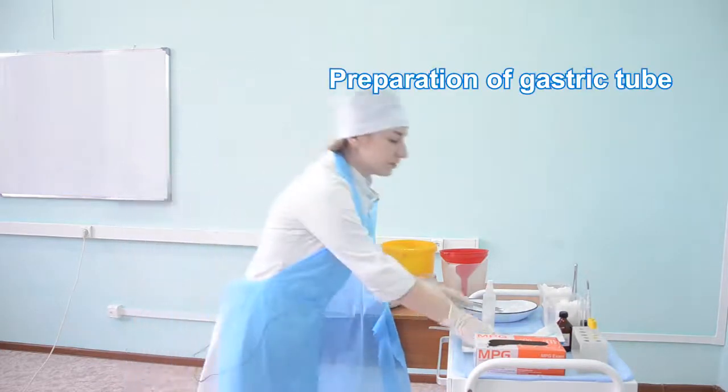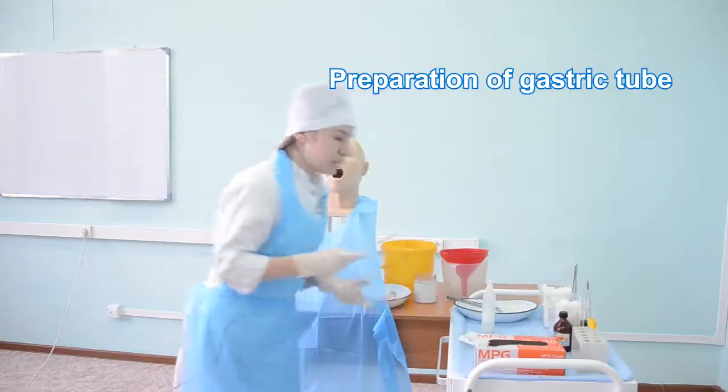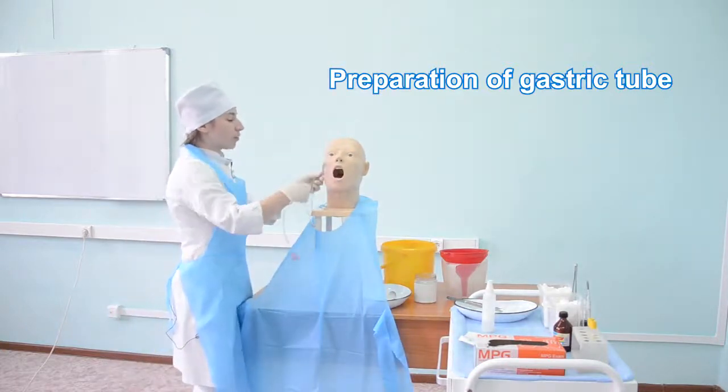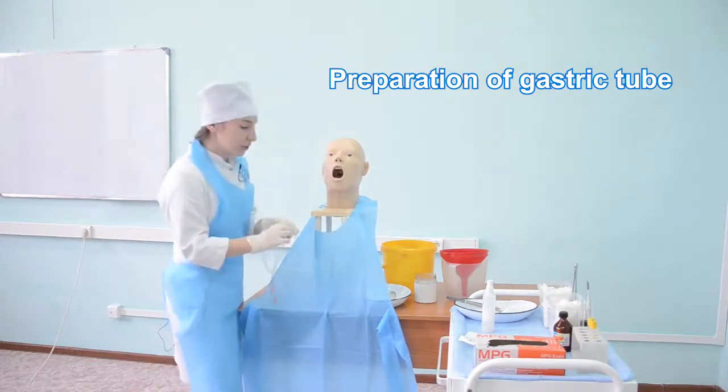Get the sterile orogastric tube and measure the needed length — from the incisors to the ear lobe, then from the ear lobe to the ensiform cartilage — and make a mark.